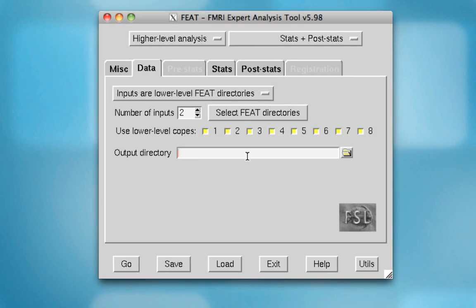And for lower-level co-PEs, so these are just parameter estimates for each contrast you did at a lower level. So for example, I know that contrast 1 represents the left minus right contrast. In this case, I'm going to select all of them, but if you want, you can select only a subset of them.